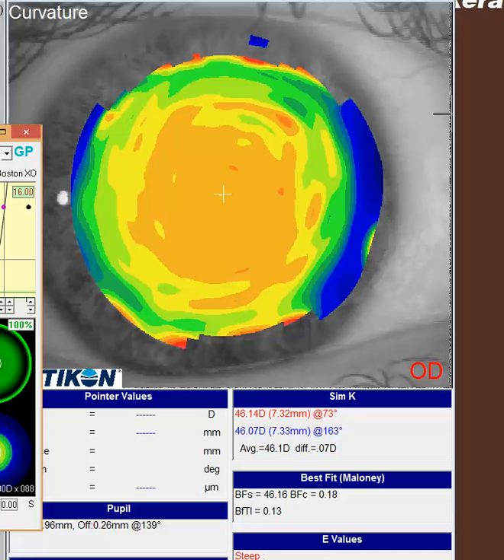There's a nice Wave tutorial. I don't know if you've seen it yet. I'll include it in the email. It shows exactly how to go about designing a lens. If you were to try that, I'd go about a 13.5 or so lens.